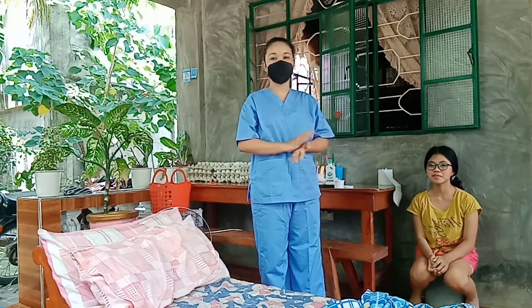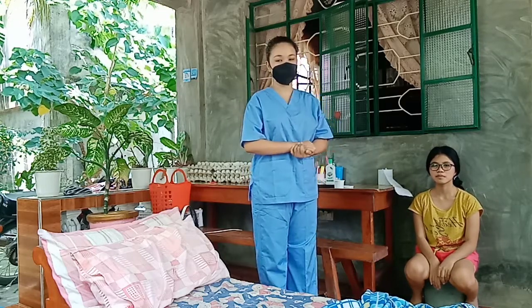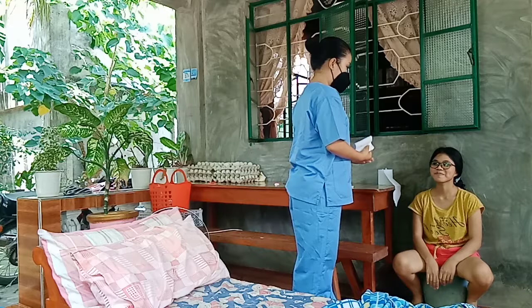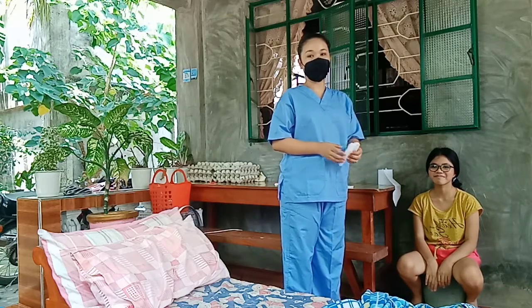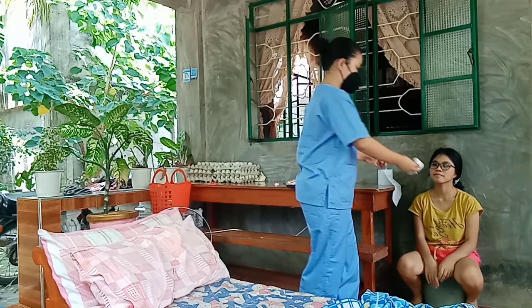Then spread labia minora with finger of non-dominant hand of patient or have patient assist. So, spread the labia minora, ma'am. Spread your labia minora. Then, clean the urethral area appropriately. Use fresh swab for each fold.